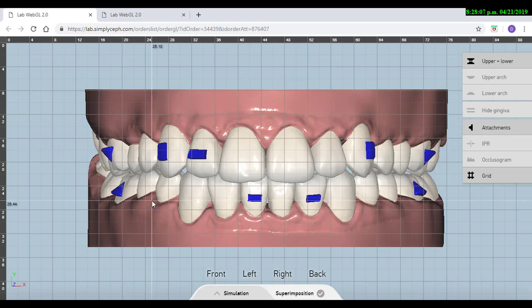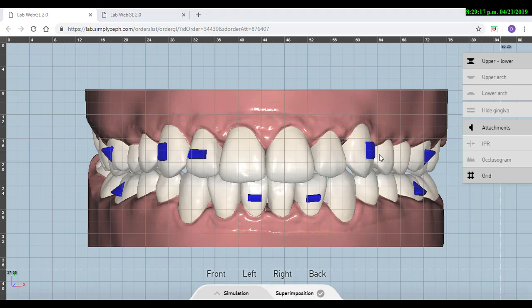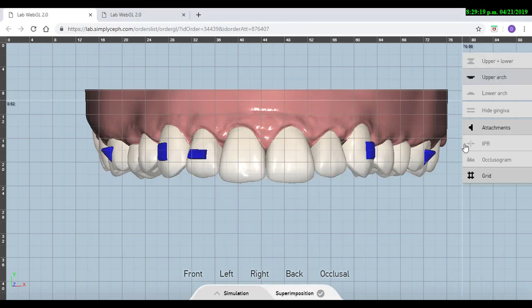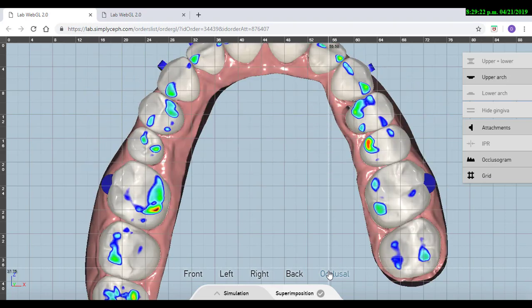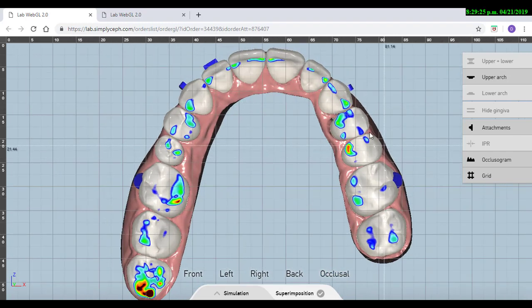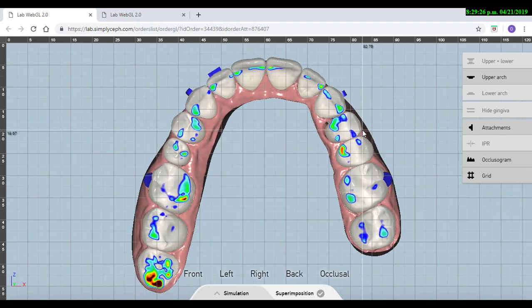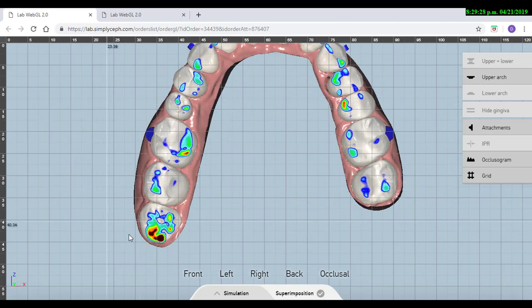Finally, we finish by checking the occlusogram. We just go select the arch and see that those contacts are almost the same.